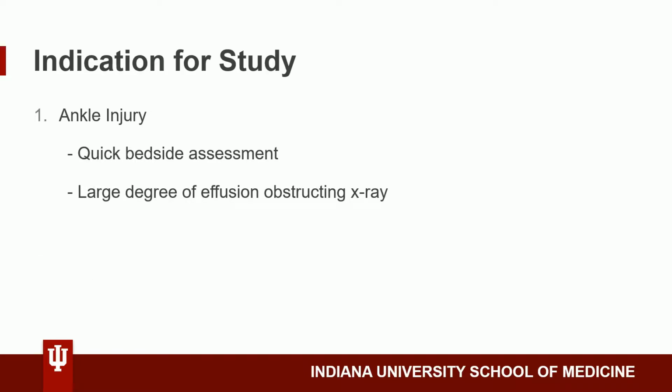Ultrasounds serve as a phenomenal bedside assessment that complements a physical exam, and when applied to Ottawa's ankle rules for imaging, it can even reduce the number of x-rays obtained without underdiagnosing fractures. In cases where we do get an x-ray of the ankle, the ability to interpret the image can be limited by the degree of effusion present. In such moments, an ultrasound can evaluate for fractures or tendinopathies with a high degree of sensitivity.